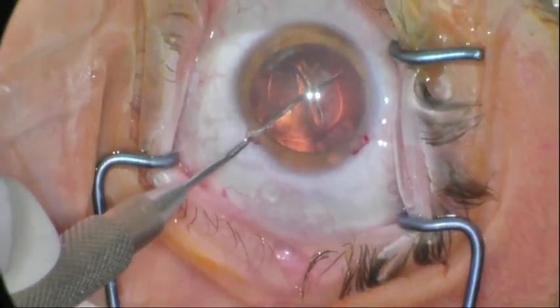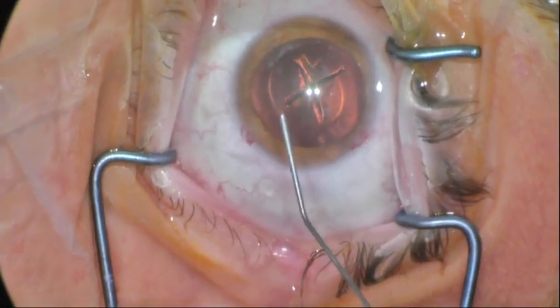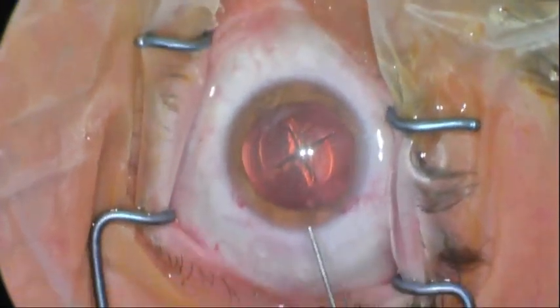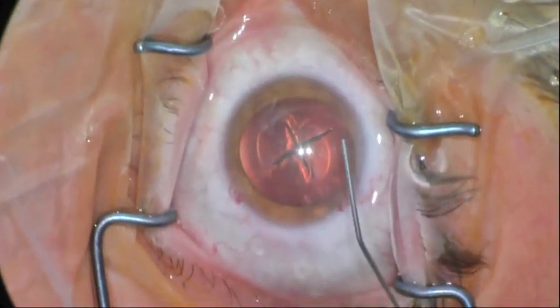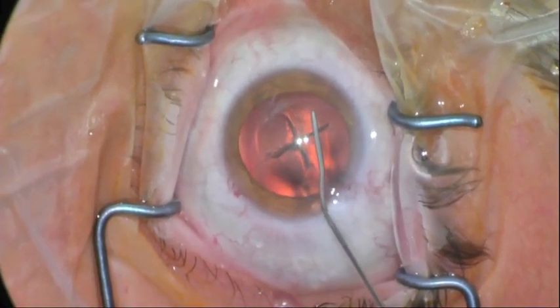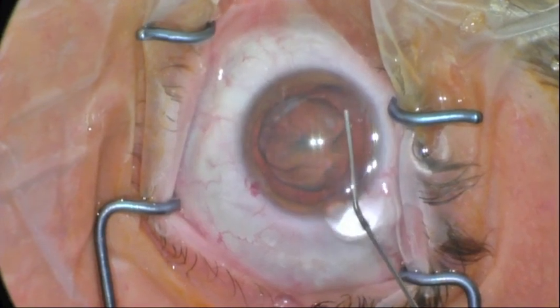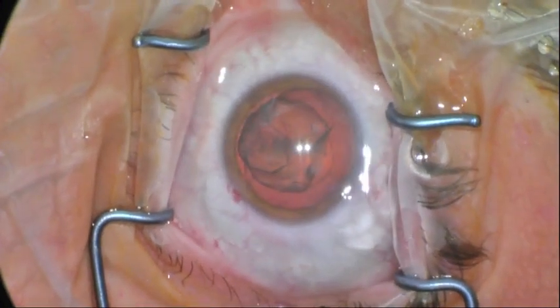Now when we do hydrodissection slowly, or hydrodelineation, the energy will be transmitted through the lens instead of posteriorly. The lens will bloom like the winter aconite flower and will blossom. In a petaloid way, we'll have four pieces that will separate from each other, joined only at the center.